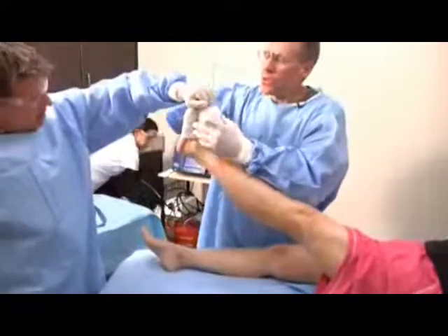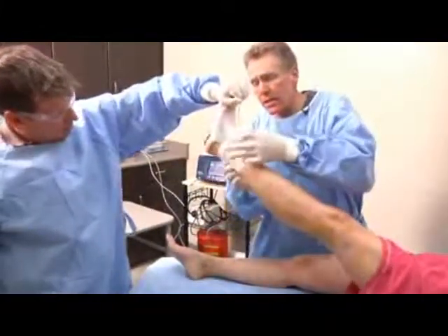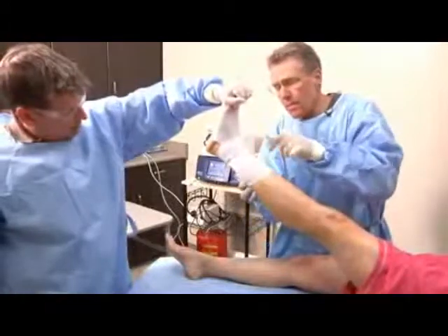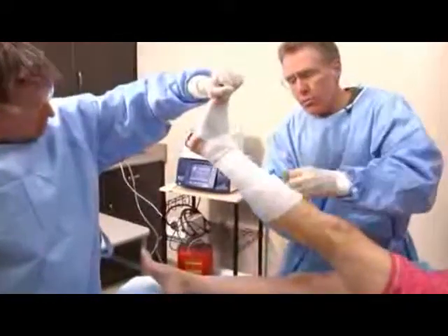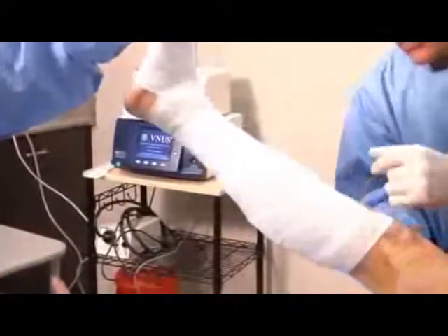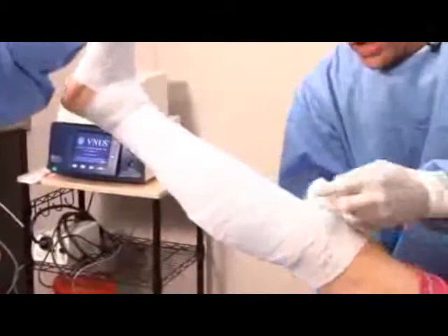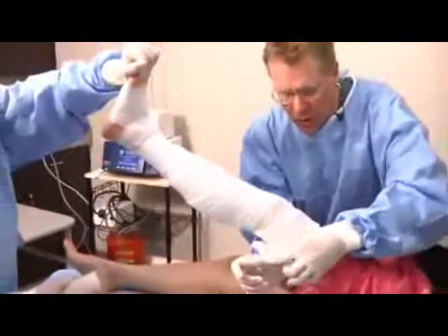We complete our procedure with a three-layer compression dressing that basically keeps that vein nice and compressed or closed as it heals. We'll leave this dressing on for two days, take it off, and then apply a support hose.